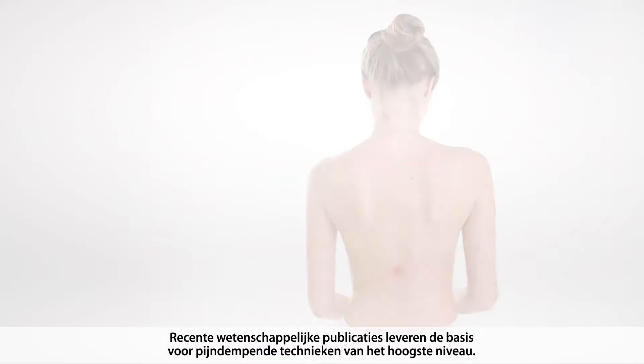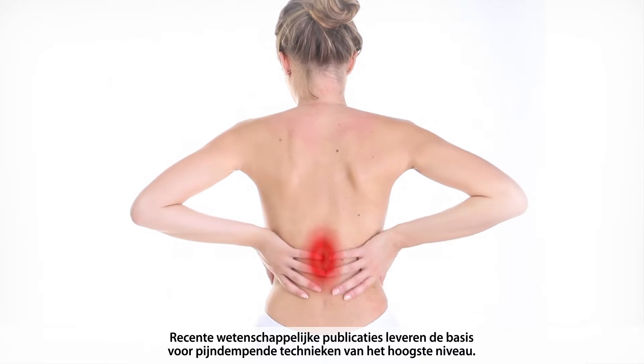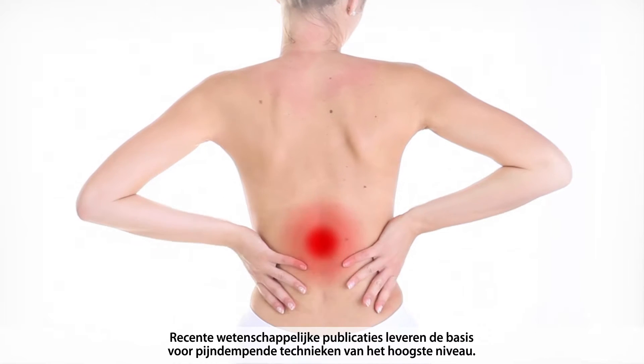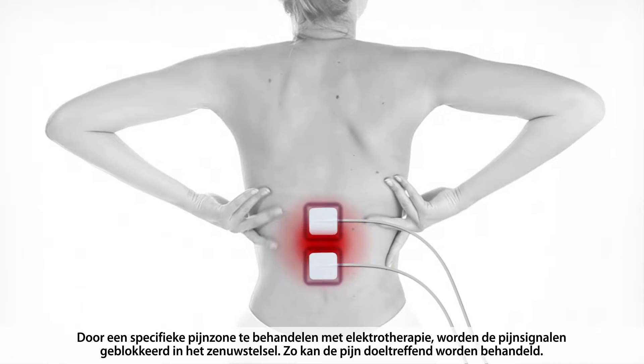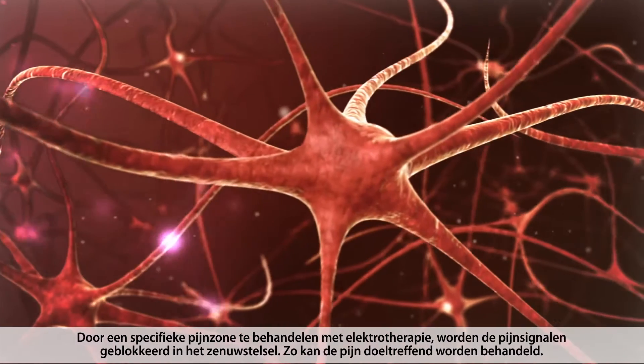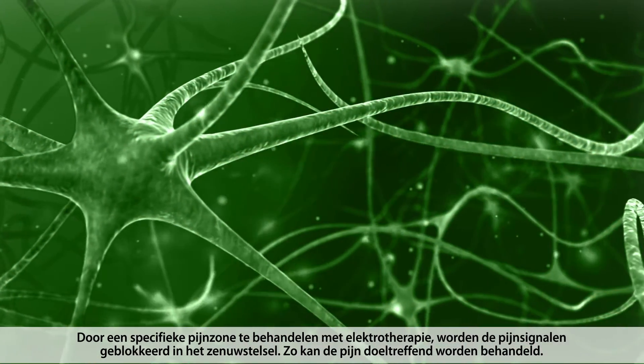Newly advanced relief techniques, developed by implementing the latest scientific evidence, guarantee pain relief at its finest. By treating a specific pain zone with electrotherapy, the pain signals get blocked in the nerve system, resulting in efficient pain relief.